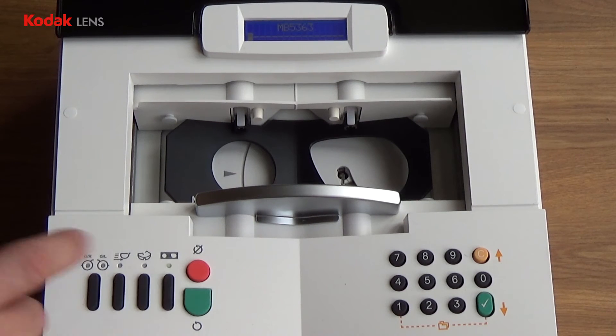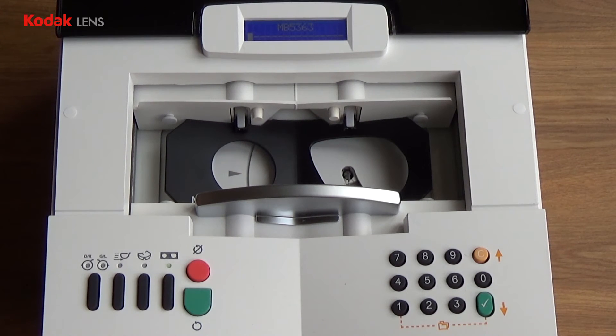Press the big green button to start the trace cycle. Once the tracer completes the cycle, it will display 'Check OK'. Press the green tick.